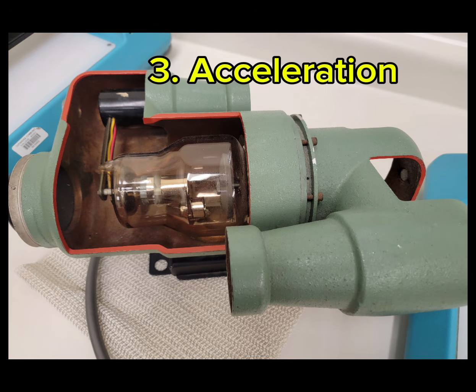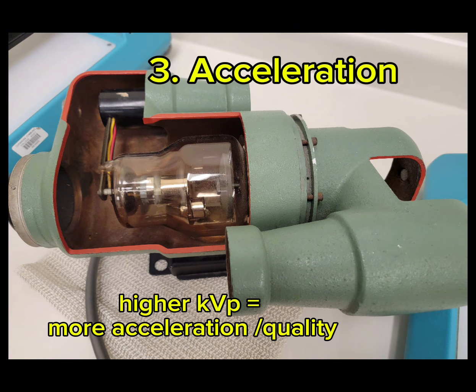Step 3, acceleration. So when we select the kVp, we are selecting the potential difference between the positive anode and the negative cathode. As we select a higher kVp, we're going to have a higher acceleration across that tube gap.